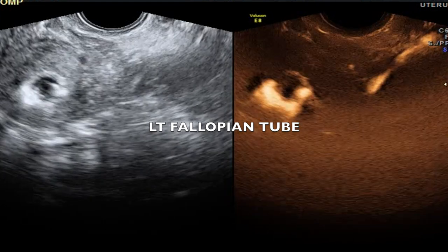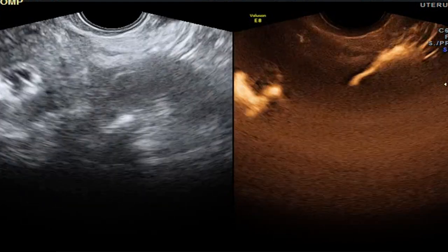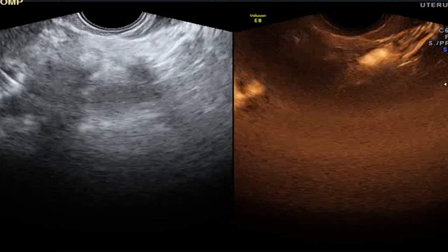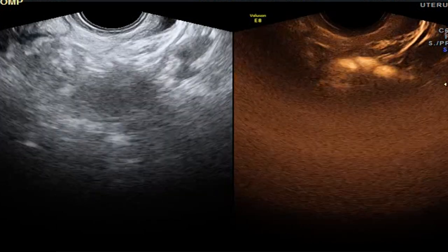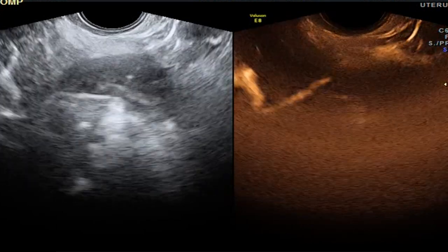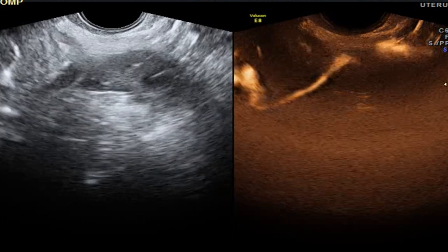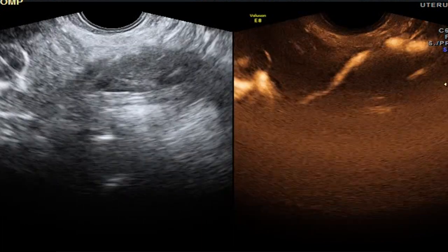This is showing the contrast agent Sonovue within the left fallopian tube, and we can trace it right up to its fimbrial end close to the ovary. We can see the active spill here, and this is the left ovary with the periovarian diffusion.